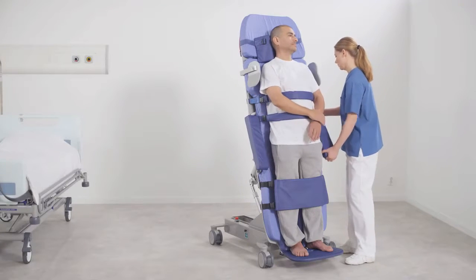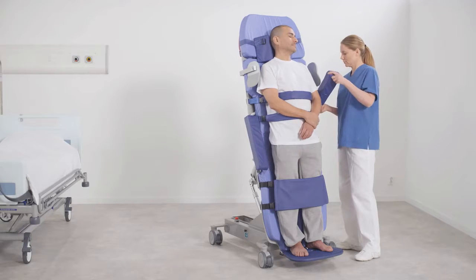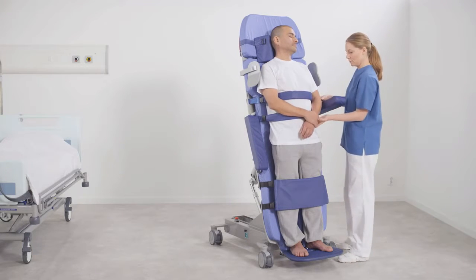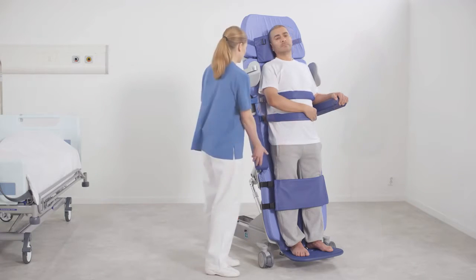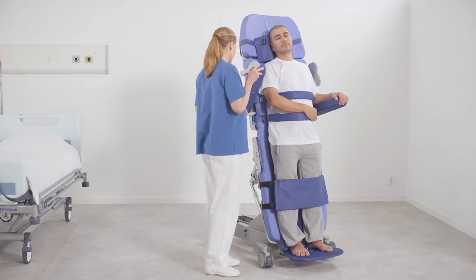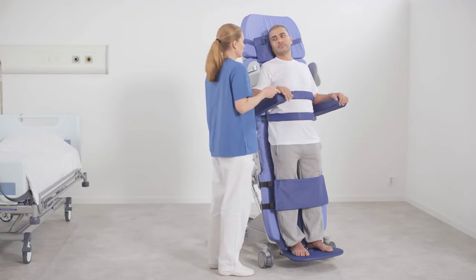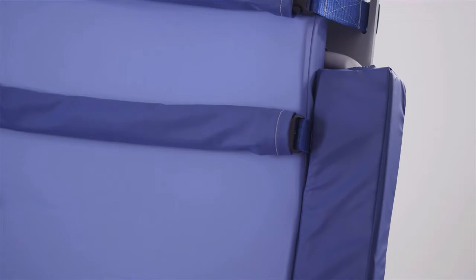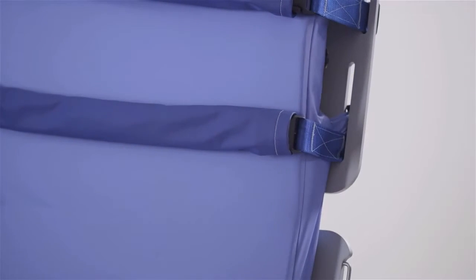To adjust armrests, lift them slightly upwards and pull outwards until the locking pin is outside the stretcher groove. Position the pin in front of the tilt table groove and push the armrest bar in to lock the armrest in position. Remove armrests by rotating them slightly upwards and pulling them out of the base.